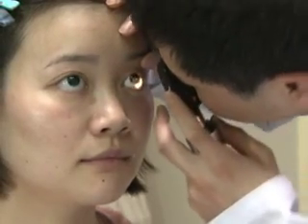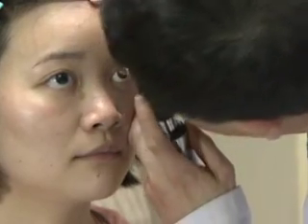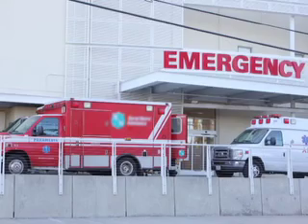Ophthalmoscopy allows the general practitioner to evaluate the retina for pathological changes, particularly in patients with common systemic diseases such as diabetes, hypertension, and atherosclerosis. Ophthalmoscopy can also help identify ophthalmic emergencies that require immediate attention.